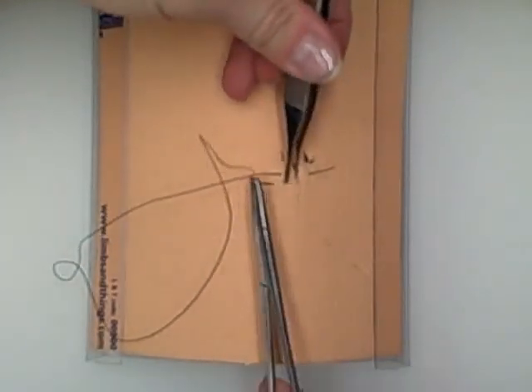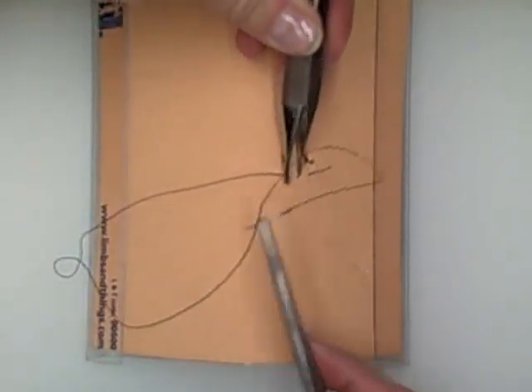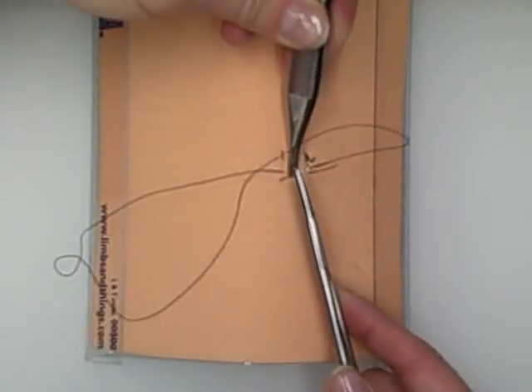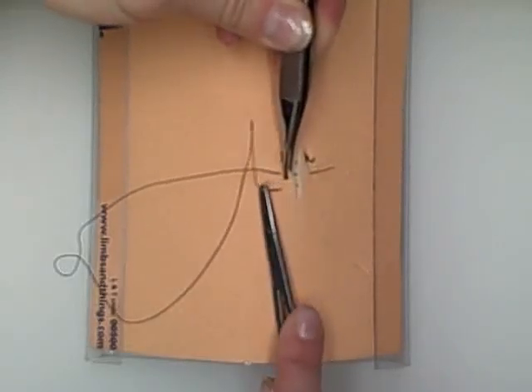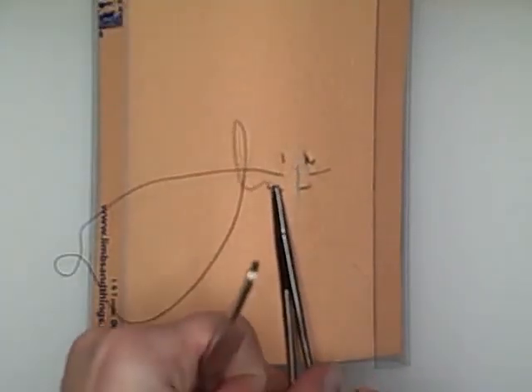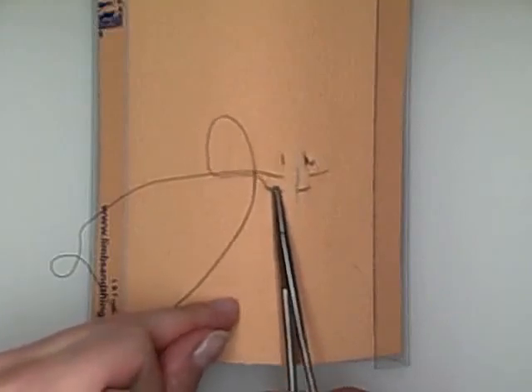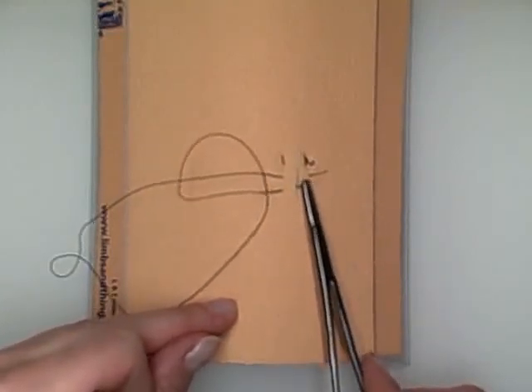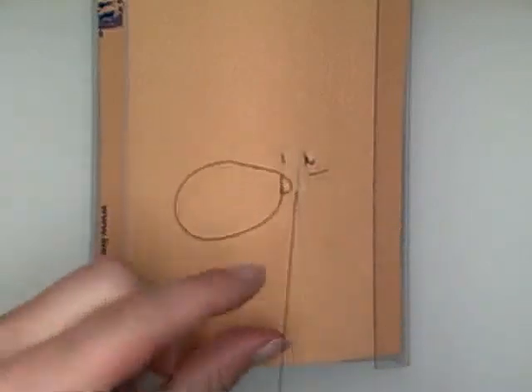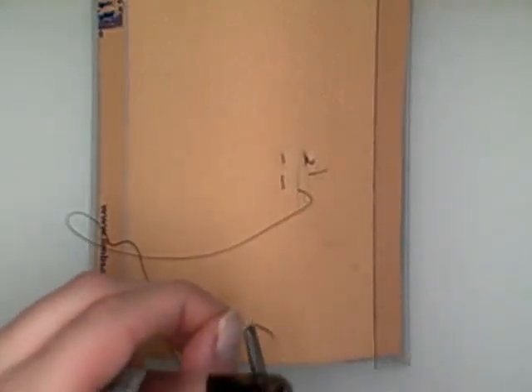Remember we reloaded our needle backwards. Again, we're going to reload it backwards.